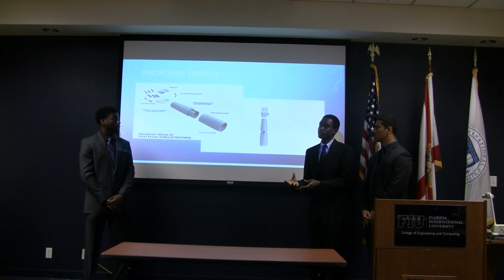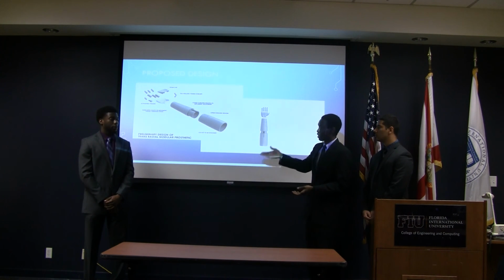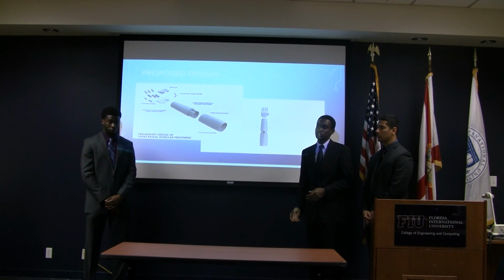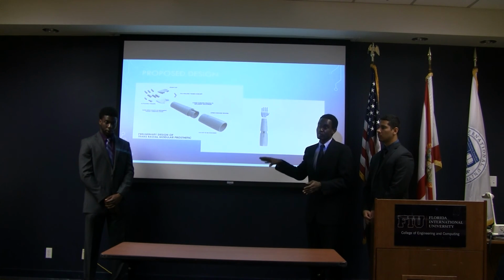The higher quality 3D printing, the better strength we're going to get in the overall product, but the lower quality, the more brittle and fragile the prosthetic will be. So it's kind of like a balance. The higher strength we get, the more cost it'll be. But we're trying to shoot under around $1,500 because we know implementing a myoelectric system by itself costs $500.